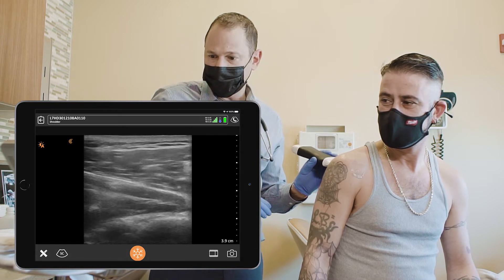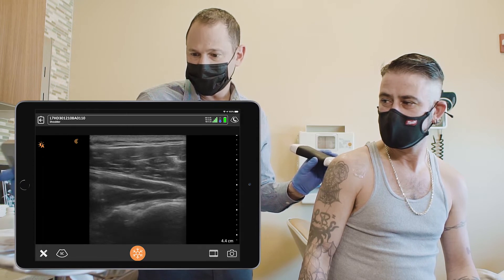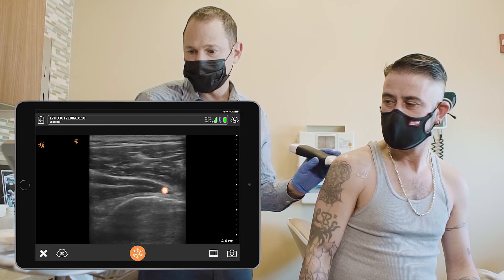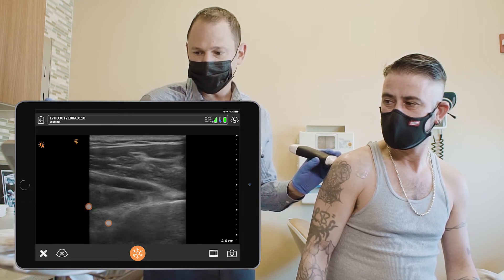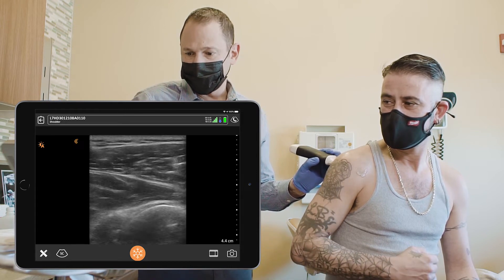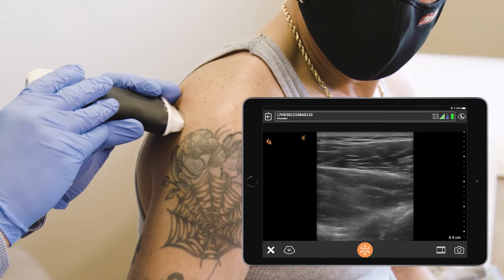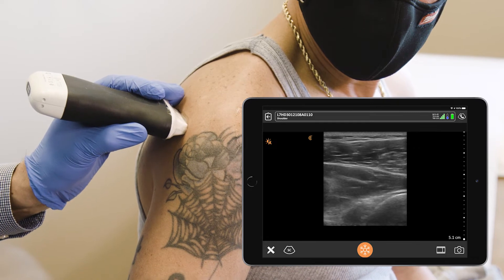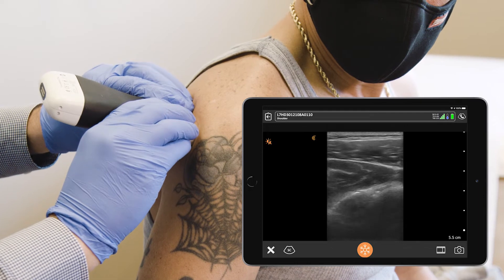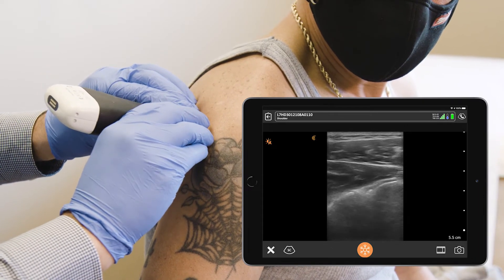Posteriorly, you can find the humeral head and identify the infraspinatus muscle inserting on the humeral head. Ask the patient to rotate his arm and you'll see the muscle and tendon move with the bone. Going medial, you'll find the posterior joint capsule, visible at the center of the screen.